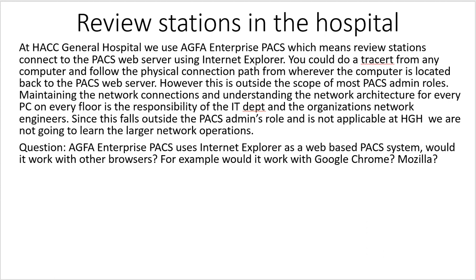Would AGFA Enterprise PACS work with Safari? No, it doesn't work with Safari. So browser-based PACS will have a list of browsers that it does support and browsers that it can't work with. So something to keep in mind.